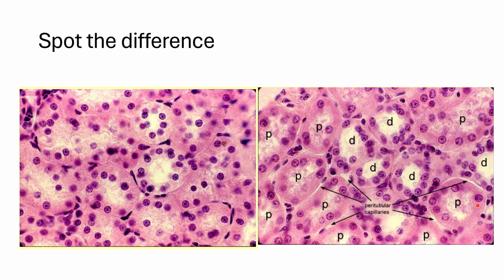And then another distinguishing feature of proximal tubule from the distal tubule is that the proximal tubule is intensely eosinophilic, as you can see here. It is more pinkish than the distal tubule. So let's wonder why it is so. This is because the proximal tubule cells have a higher proportion of mitochondria in their cytoplasm that provide energy for pumping ions and molecules against the concentration gradient.